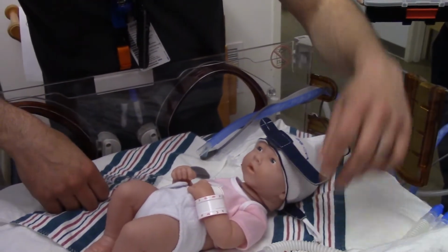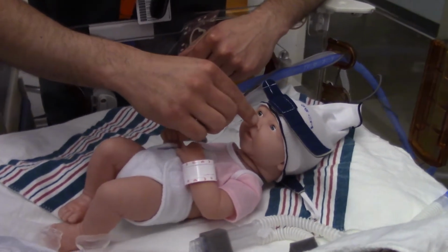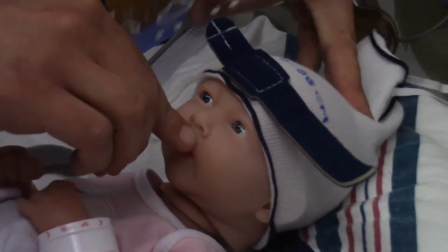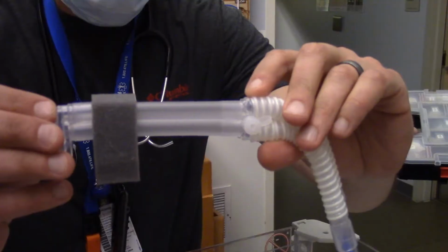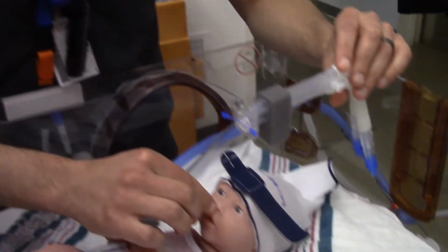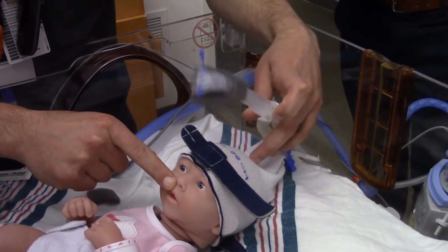How we're going to determine that? We are going to take from the baby's nose, right above the upper lip, underneath the septum, to the top of the head. And you can see this frosted trunk part from here to here, right where this white swirly tubing ends, or begins rather. This frosted part, we want to sit from here to the top of the baby's head. Again, above the lip, top of the baby's head.